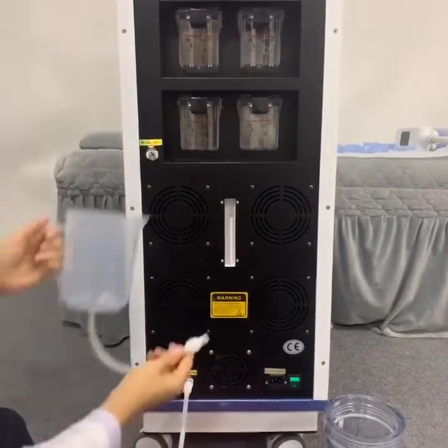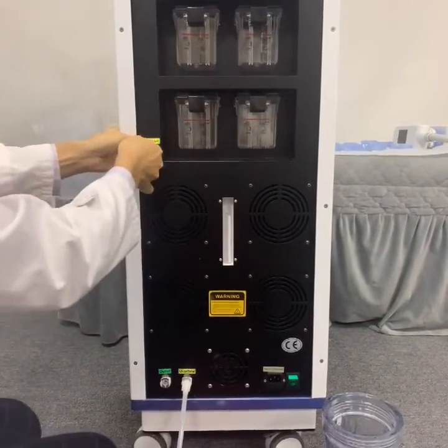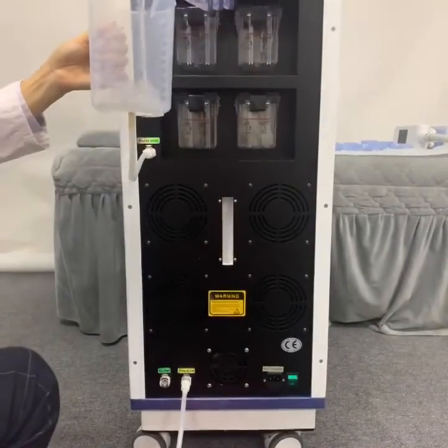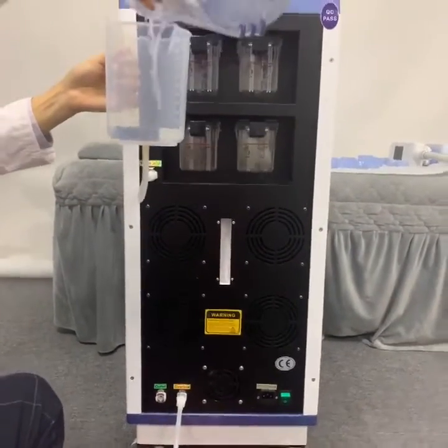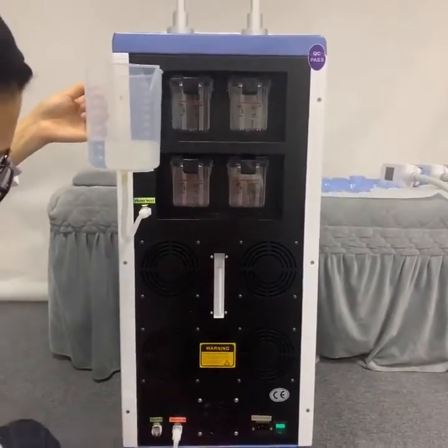Another water cup we will insert to the water inlet hole — the same operation. Press the silver button first. Now we will inject the water. If the water is full inside, it will come out from the water overflow hole.